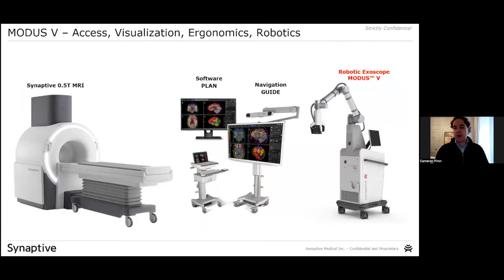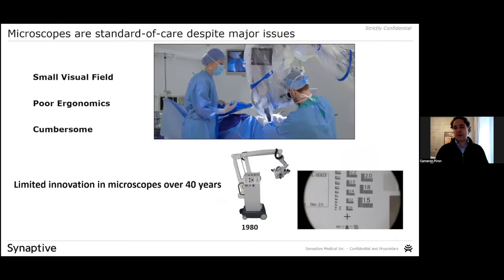So we developed a robot, very much to address a need in the operating room and to replace something that we saw as a really challenging piece of equipment. Particularly in neurosurgery, surgeons use something called an operating microscope. That's what you see here: a surgeon looking down two oculars. If you've ever been in biology class, you put your eyes against these two lenses, all the light gets condensed to a single point in space, and you get this really great high magnification view, as you see in the bottom right, down to 10 micron resolution. So very small, and that lets you see very fine vessels and nerves so that you can either avoid them or actually do surgery on them.